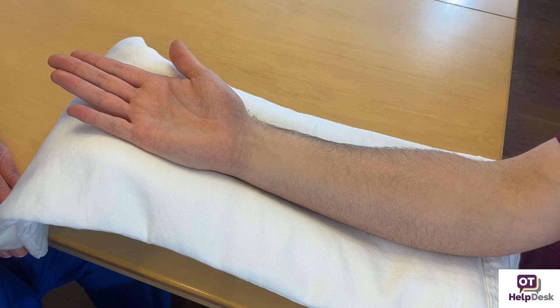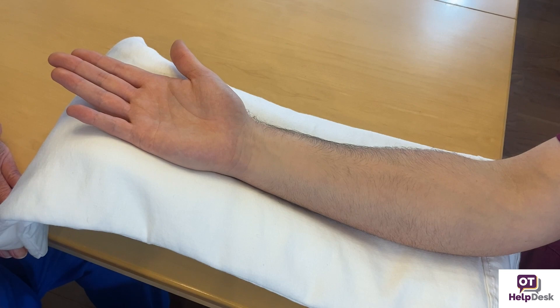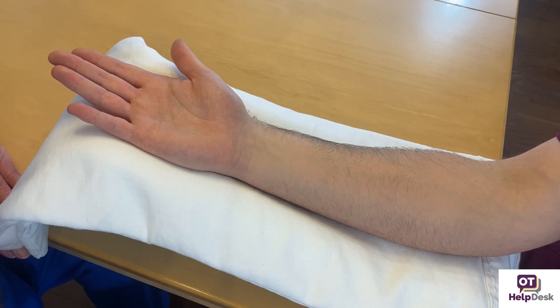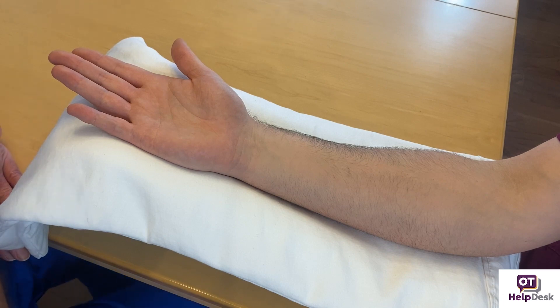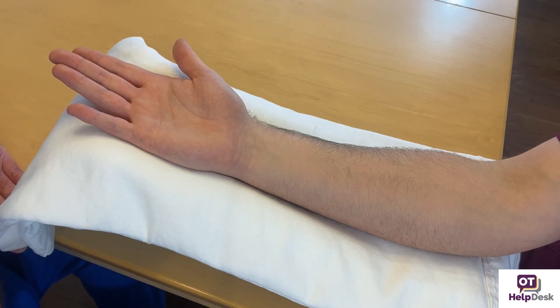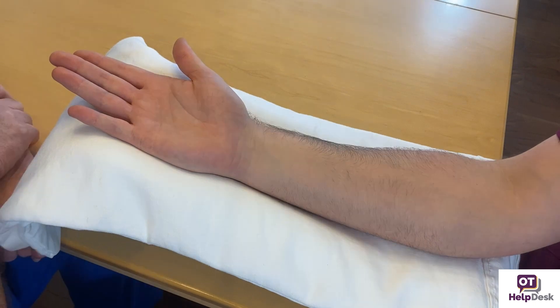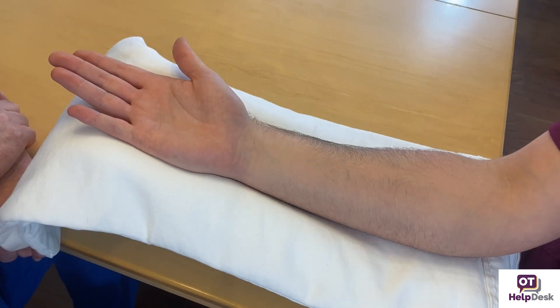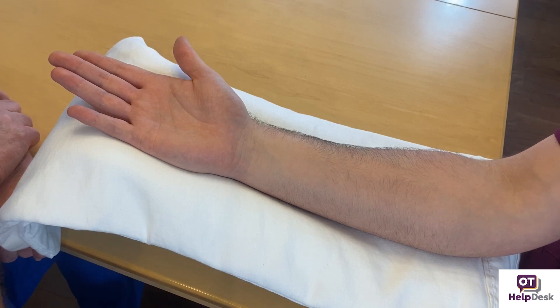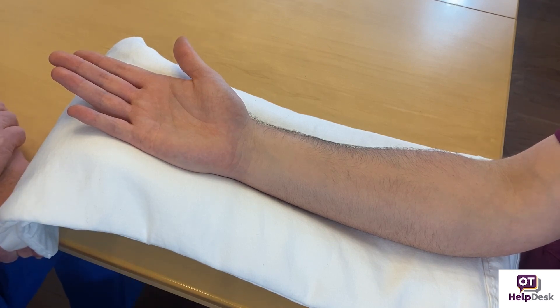What we really look for is mapping improvement after nerve repair when using this methodology. And keep in mind — great test question — which comes back first: moving two-point touch or static two-point touch? It seems counterintuitive, but moving touch actually returns before static touch.